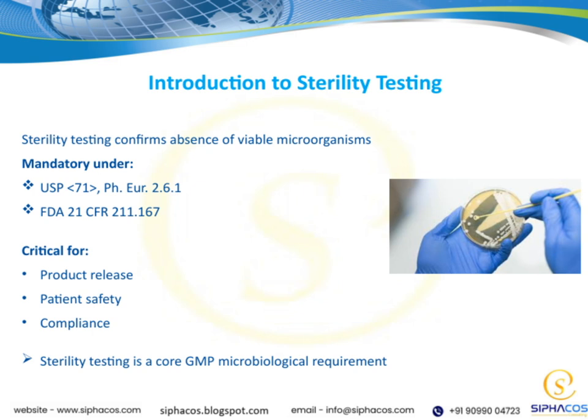Now, why is this so critical? Well, sterility testing plays a vital role in product release. It's one of the final checks before a product reaches the patient, ensuring safety and compliance. Without it, we risk releasing products that could cause infections or other adverse effects.